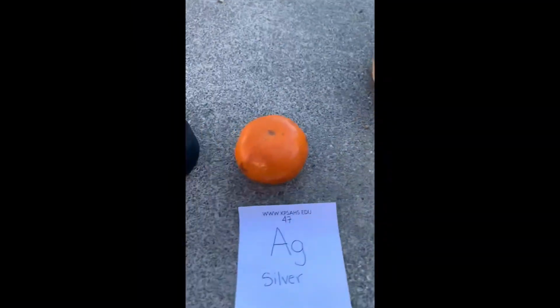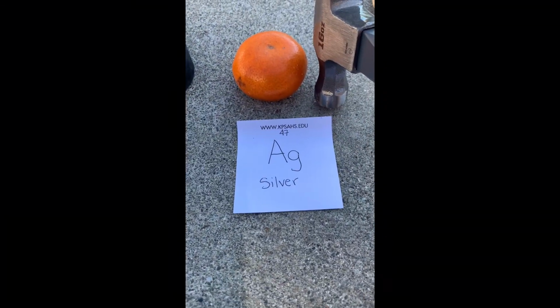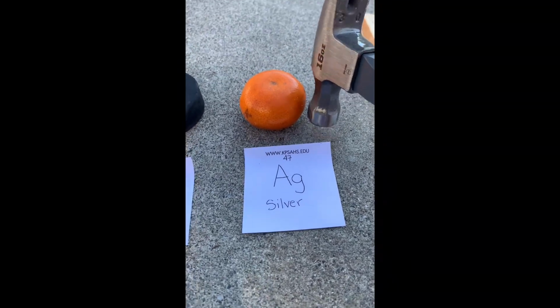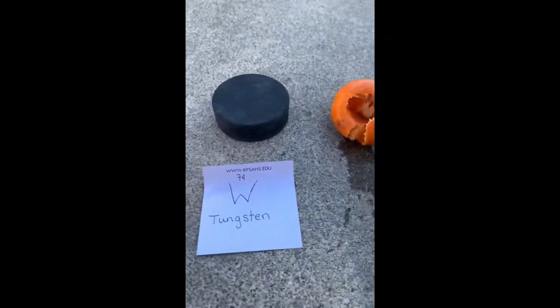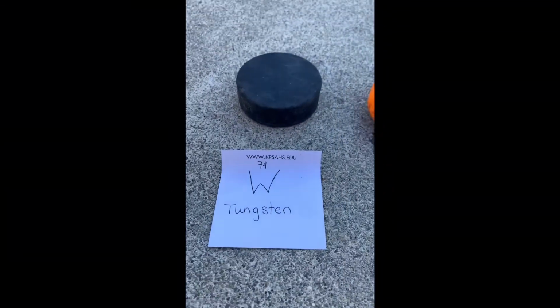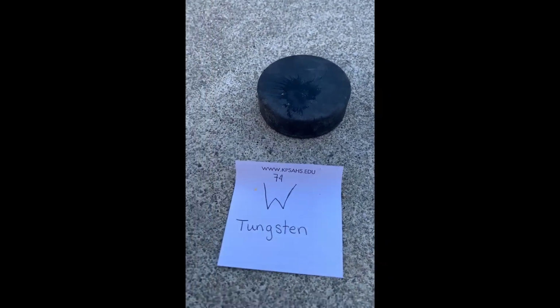Pitting. Next, I'm going to show you if our target was made of silver, which has an atomic number of 47, also wouldn't work. And lastly, tungsten with our high atomic number of 74, no pitting, no cracking, very sturdy.